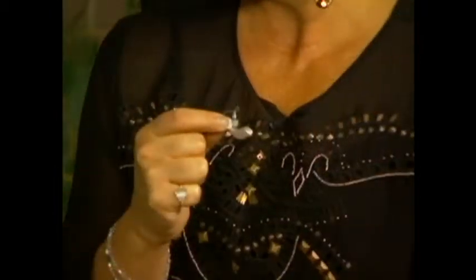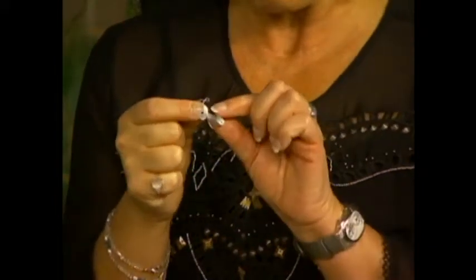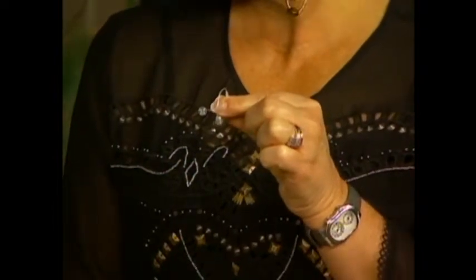And there is truly a device to wear in the ear canal, outside the ear canal. They can even look more fashionable. I mean, it's amazing what you can offer people. They look today more like Bluetooth devices than hearing aids nowadays. They really do. Yes. I'm going to hold one up because this is what your average hearing aid looks like today. That is an example of something called an open fit or a receiver in the ear hearing aid. It does go behind the ear, but they have different colors that can match your hair or your skin. They are so cosmetically appealing to people that people who may not have wanted to try them in the past are more open to trying them now.